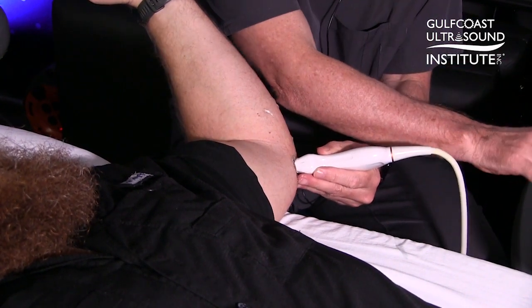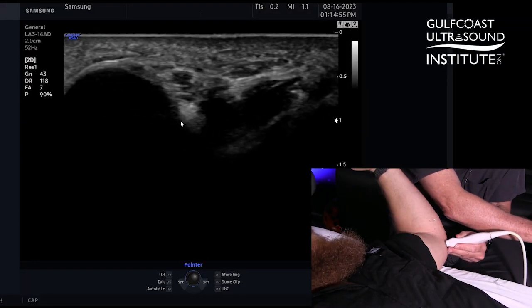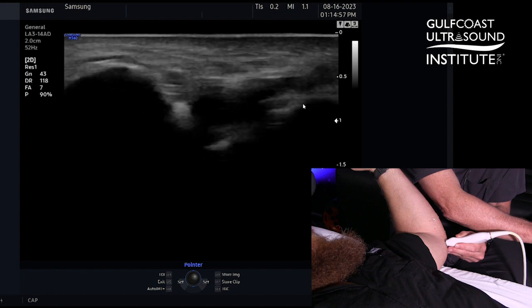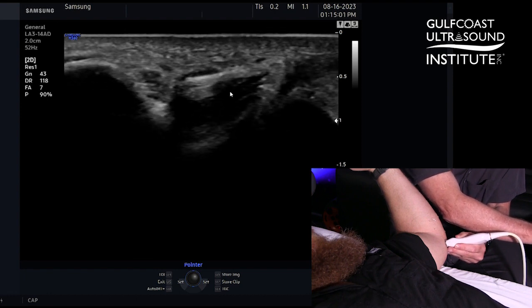We'll see those bony acoustic landmarks here. Over here is the medial epicondyle, and this is the olecranon to this side. You can see the ulnar nerve there and the medial triceps muscle there.